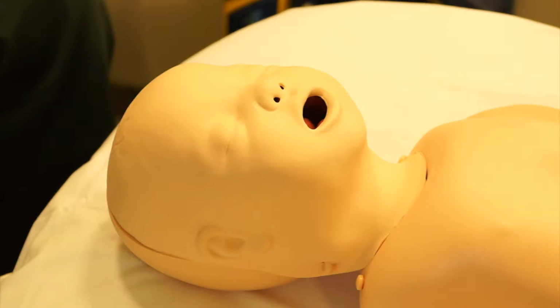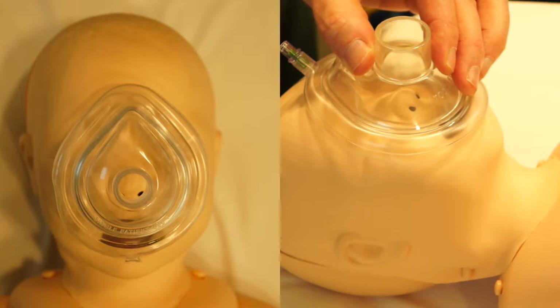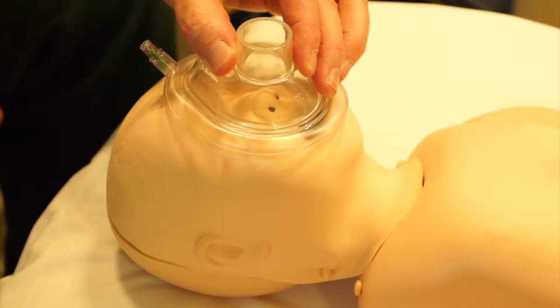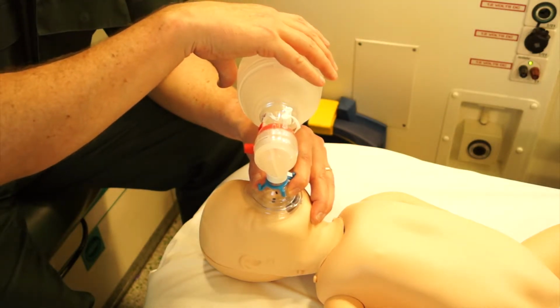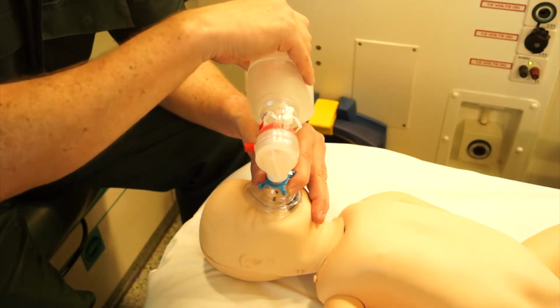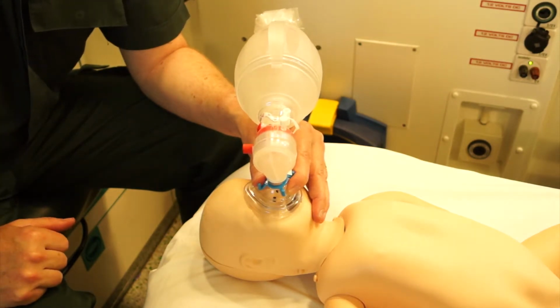If you fail to achieve 5 successful inflation breaths, check the size of your face mask. A poorly fitting face mask could result in ocular pressure, which could cause vagal stimulation. Once you're happy that your face mask is fitted correctly and is the appropriate size, ensure that you did not ventilate your patient too quickly. This can result in failed ventilations.